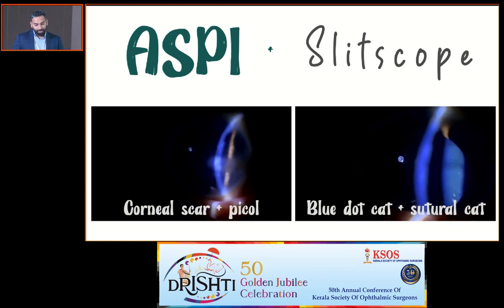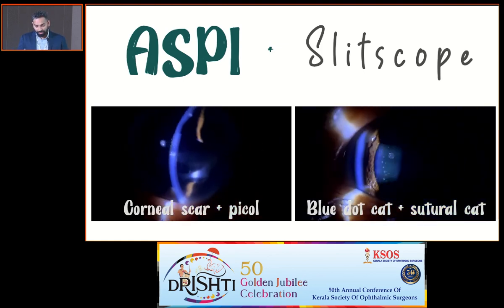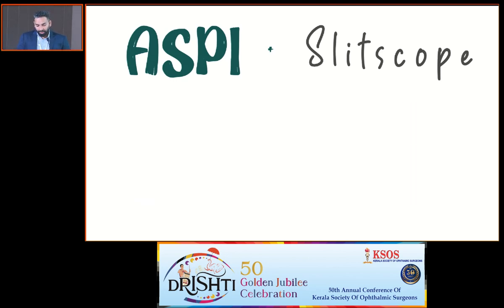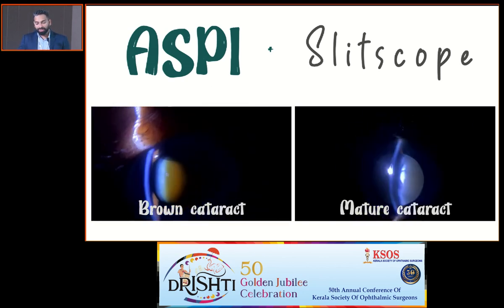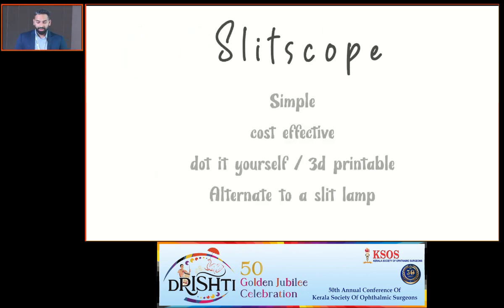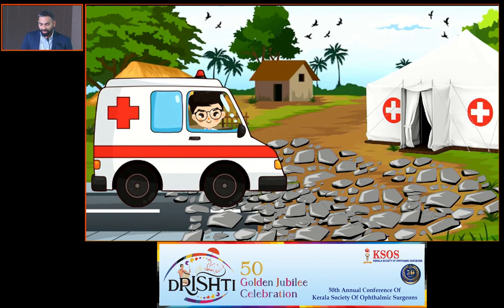So yeah, over here we have corneal scar, PCIOL, blue dot cataract, sutural cataract. You can see brown cataract and mature cataract being taken with this. So this is what ASPI and Slitscope we have been using in our camps right now. So it's simple, cost effective, and it's do it yourself. Can be an alternate to a slit lamp in the future.